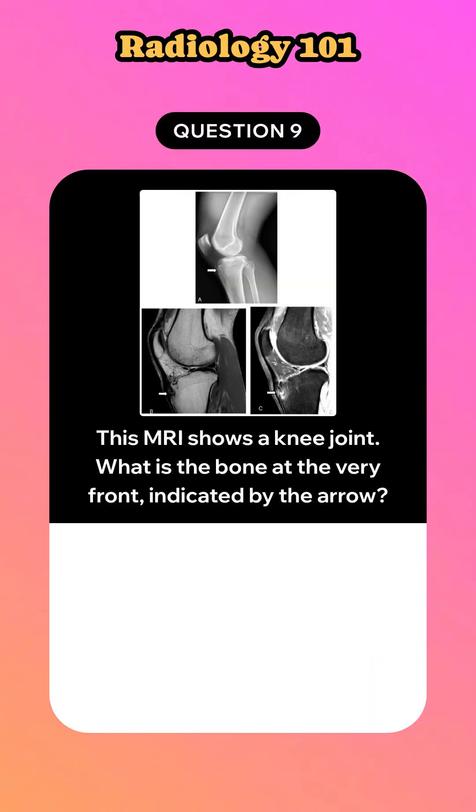This MRI shows a knee joint. What is the bone at the very front indicated by the arrow?